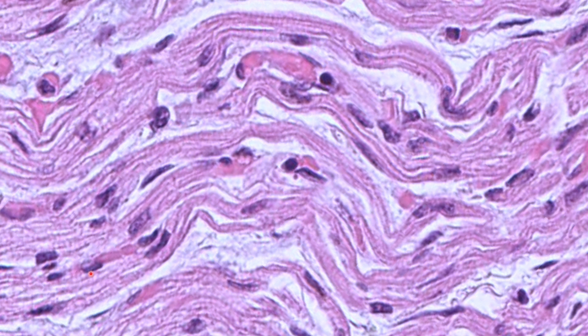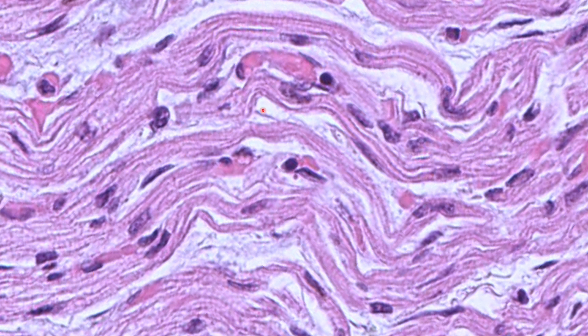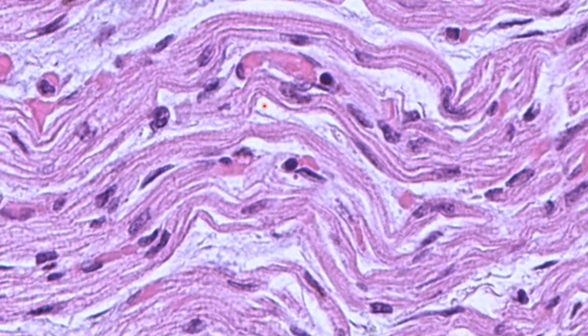If you feel it's difficult to pick up striations on light microscopy, there's a stain called PTAH — phosphotungstic acid hematoxylin — which will beautifully highlight striations. Whenever you see skeletal muscle as part of a soft tissue excision — a mastectomy with pectoralis attached, or an amputation — go and look at how the muscle fiber looks. It should have striations; that's how a striated muscle fiber looks.